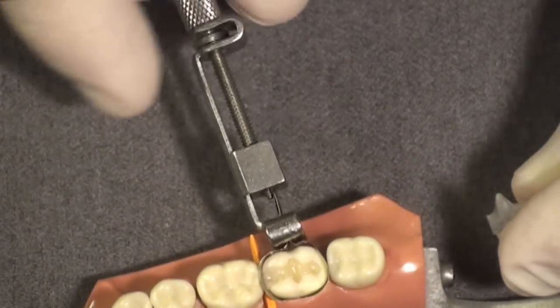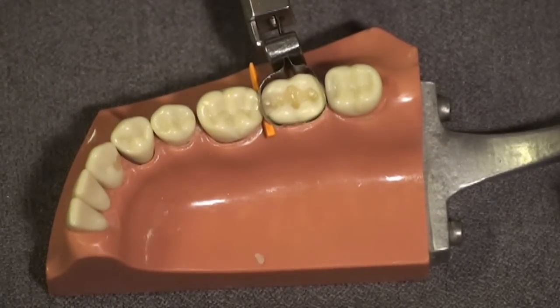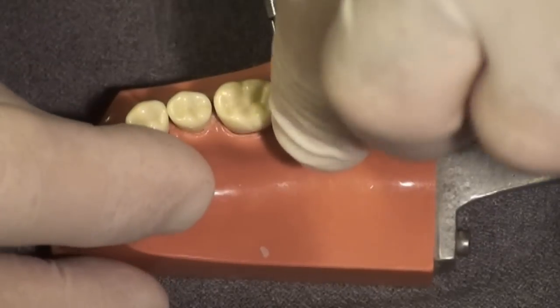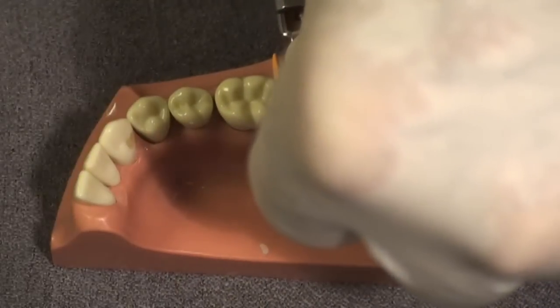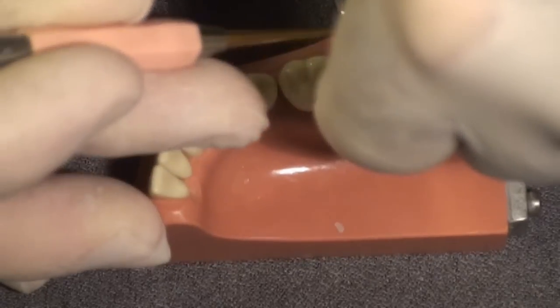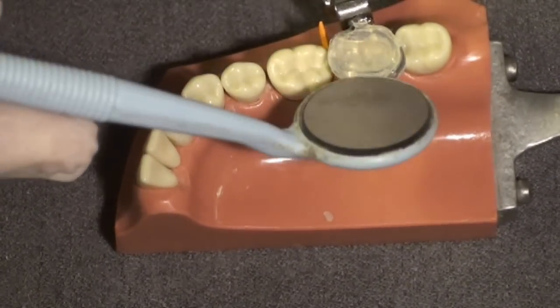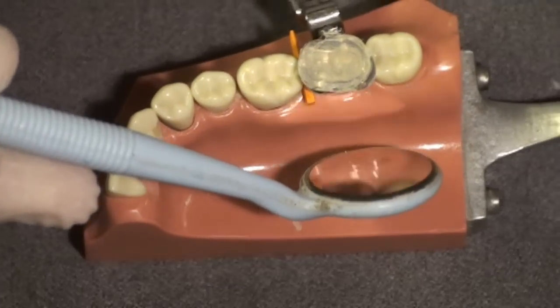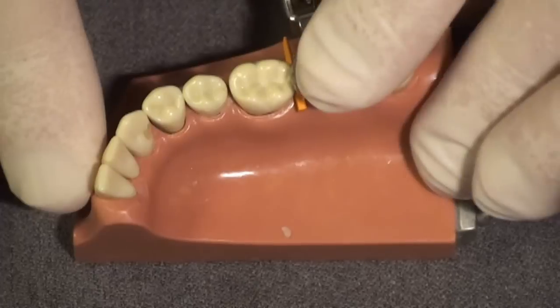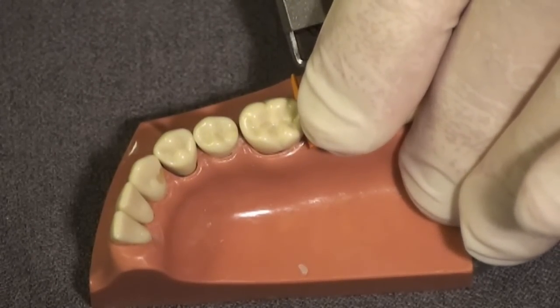The trick here is to loosen the matrix band a couple of turns so that you can place the clear custom matrix inside the matrix band. It needs to sit entirely inside the matrix band — you may need to force it in. Check it on the lingual with a mirror to make sure it's completely inside the band, then place your finger on it and apply pressure while you retighten the matrix band to the same tightness as earlier in the procedure.